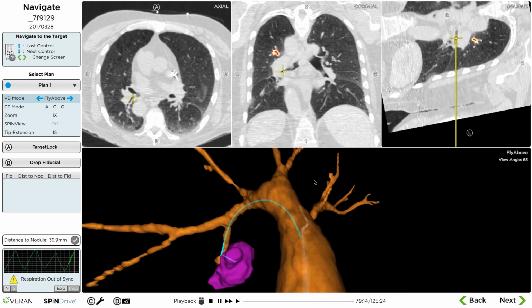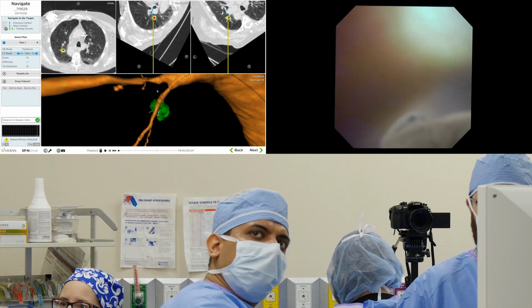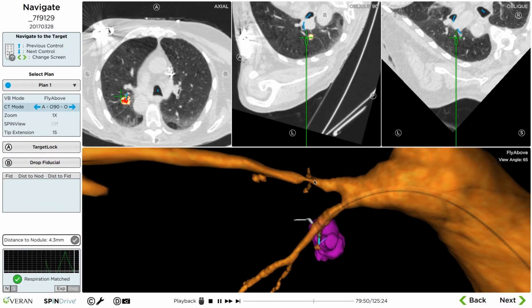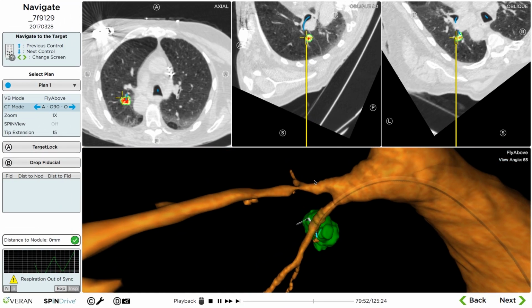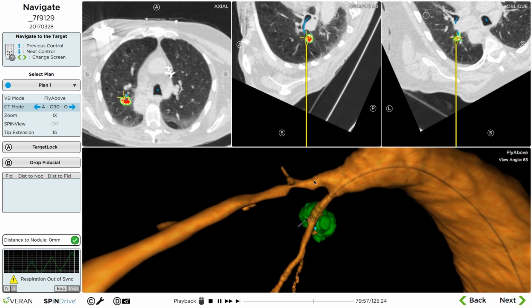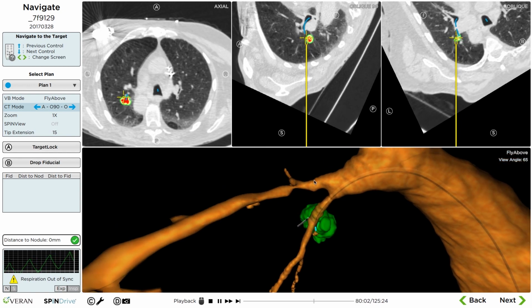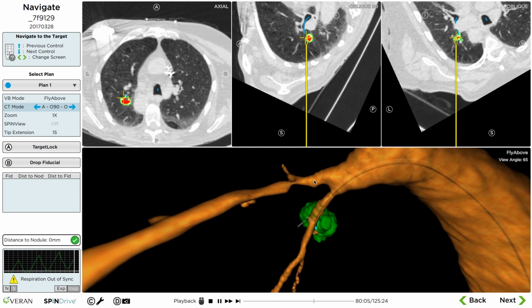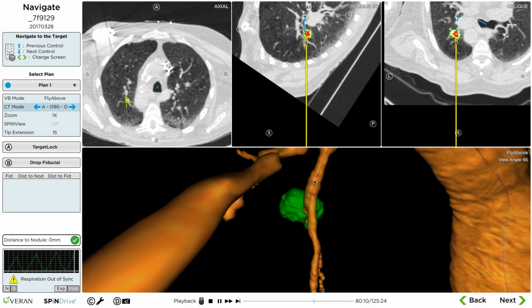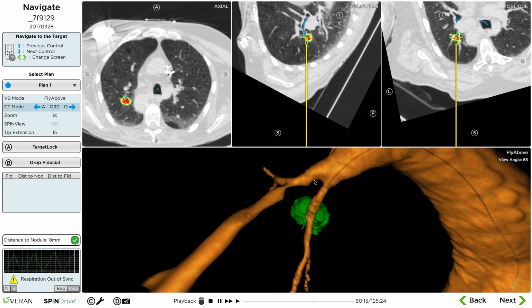All right, let's go to our nodule. So I'm still a little anterior, huh? This is a little anterior, but it's showing he's been in it. All right. Okay, you ready? Left upper nodule. Okay. Fine. No, okay, that's fine.